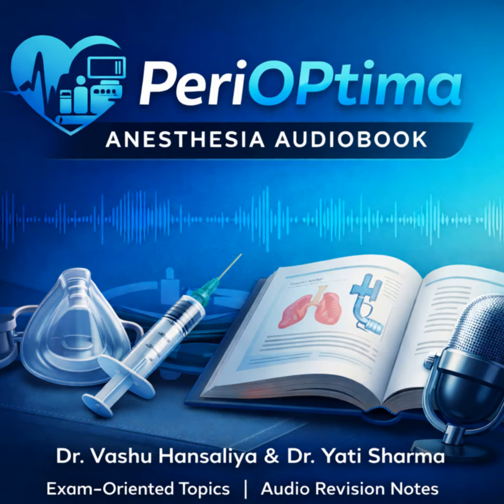Which makes maintaining spontaneous ventilation, or SVA, the single most important safety rule of AFOI. It is the absolute safeguard. If you fail to intubate, the patient is still breathing. Losing SVA is a clinical disaster in a difficult airway patient. It's the one thing you must prevent.